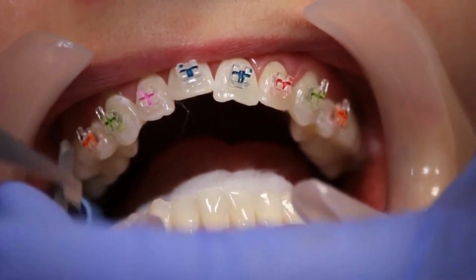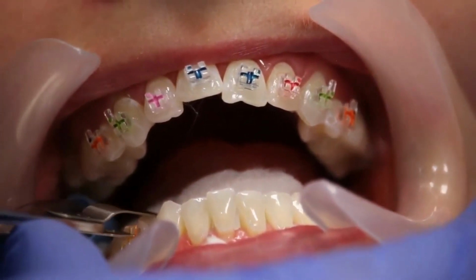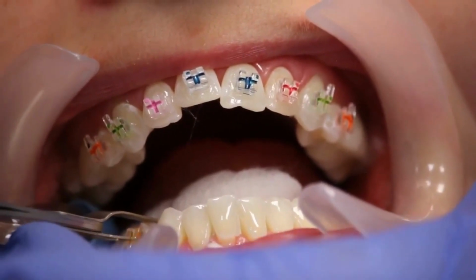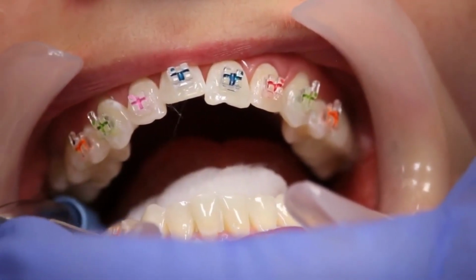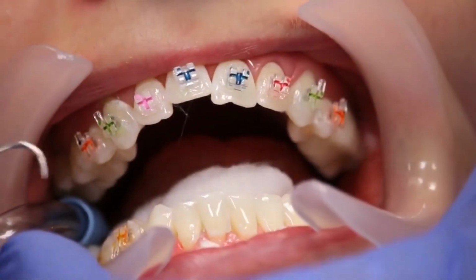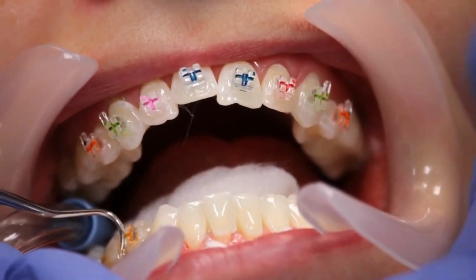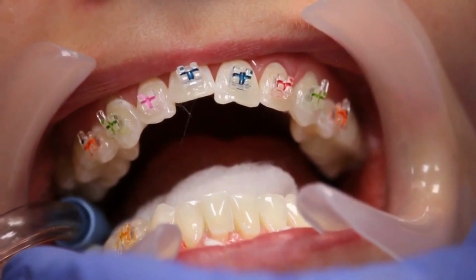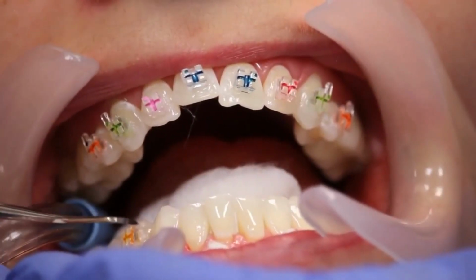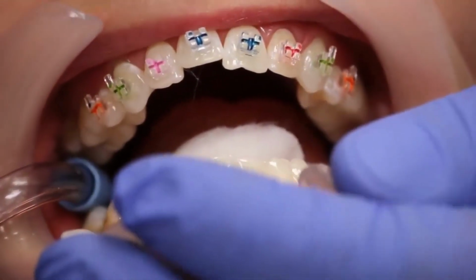Please notice that even though I'm using my left hand for support, I'm not putting my fingers anywhere near the teeth. Using the height gauge, I position my bracket at the desired height. Little adjustment here for the angulation with the end of the gauge, and a quick check for the height. That is correct. So then we move on to the next bracket. And I can just refine the planing if necessary while the next bracket comes to my hand.